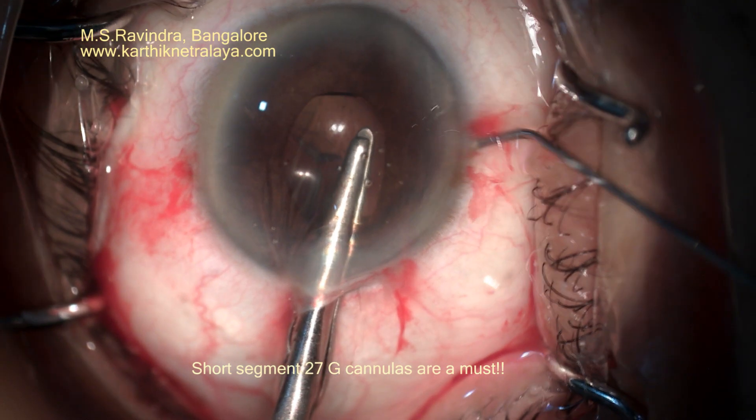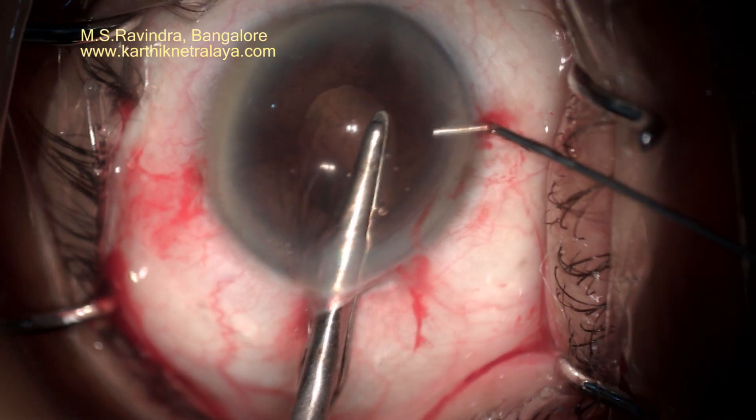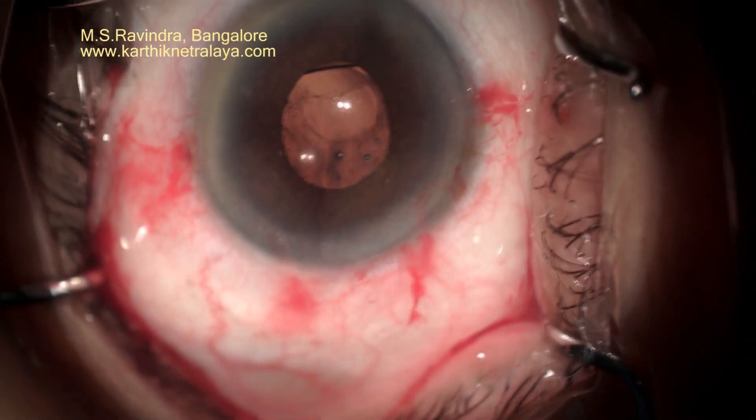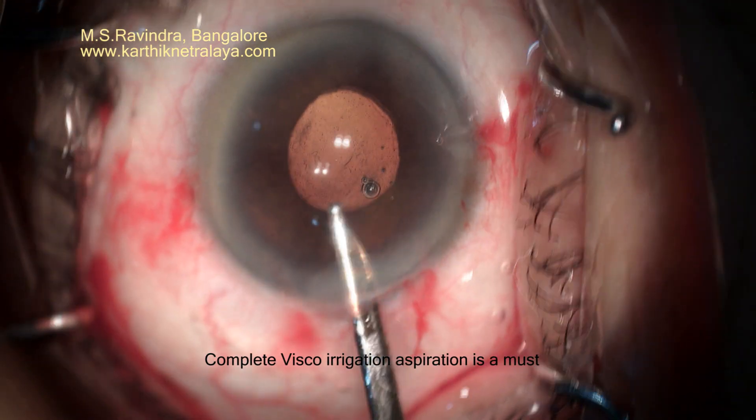A large cannula can sometimes be very unwieldy, and a short 2 to 3 mm long bent 27-gauge cannula is excellent in situations where there is lesser space between the upper lid and the cornea.